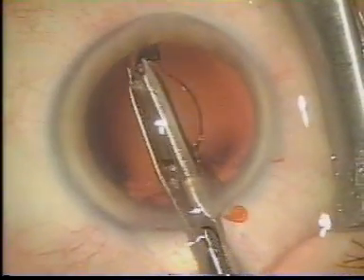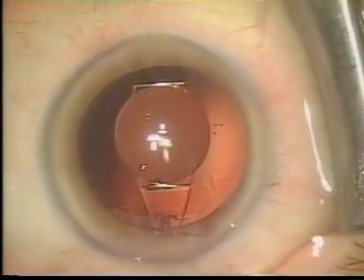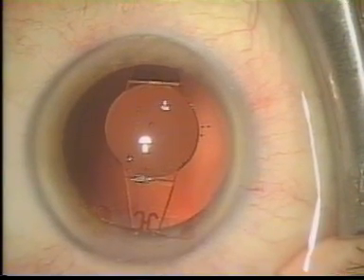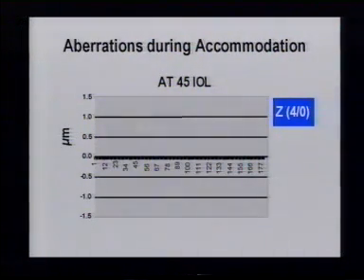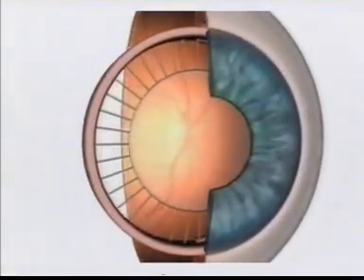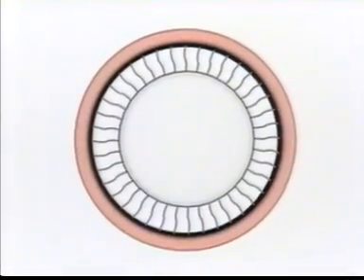The theoretical mechanism of efficacy of this IOL is based on the concept that with accommodative effort, redistribution of the ciliary body mass will result in bulking posteriorly and impinging or pressing on the vitreous face peripherally, increasing vitreous pressure. This forces the optic forward anteriorly within the visual axis, creating a more plus-powered IOL. A similar mechanism is assumed in the one-piece acrylic 1CU accommodative IOL from Human Optics.